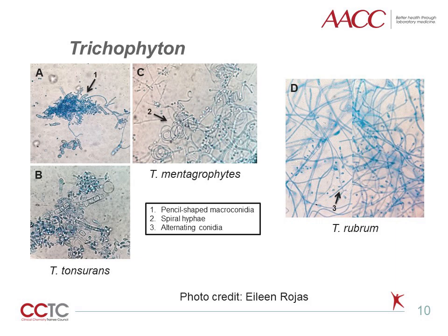Trichophyton tonsurans is exhibiting both microconidia, smaller, and macroconidia, larger, in Figure A. A pencil-shaped macroconidium is identified by a number 1 in the top right image. Figure B is a higher magnification to better show the details of the conidia. Trichophyton mentagrophytes, Figure C, has many conidia that are typically round or teardrop-shaped, and this isolate also exhibited spiral hyphae, number 2, which isn't always observed.